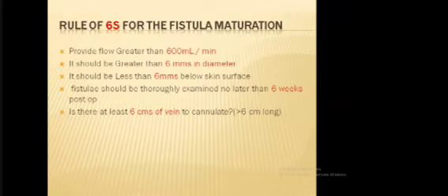The fistula should be thoroughly examined not later than 6 weeks post-op. At least 6 centimeters of vein are required to cannulate. So these are the 6s.